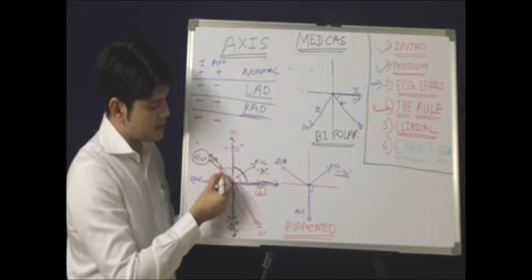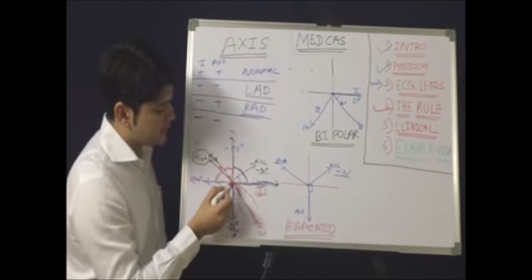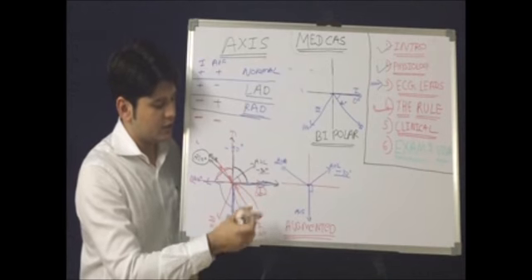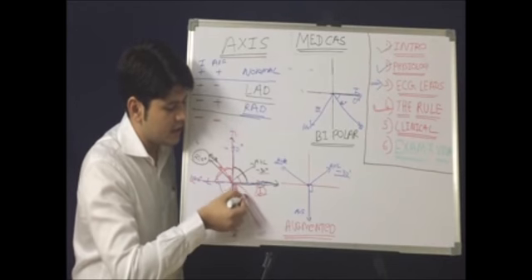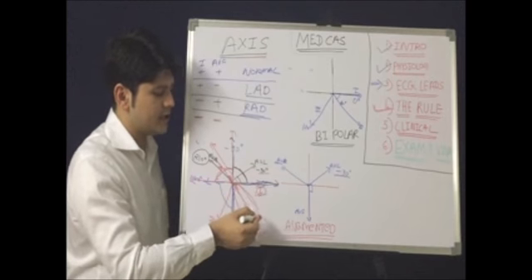So the current is between these two, lead 1 and lead AVF. Fine. So what we find here is the current is flowing towards that, and what we learned in physiology, SA node, AV node and the ventricle. So either the heart position is totally changed or the electrical flow is coming from the ventricle and going towards the atria. Okay, that happens in ventricular tachycardia.